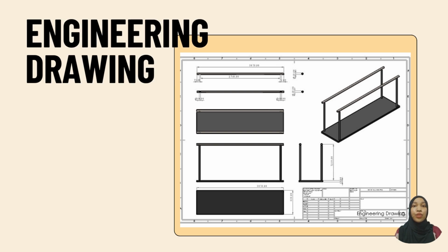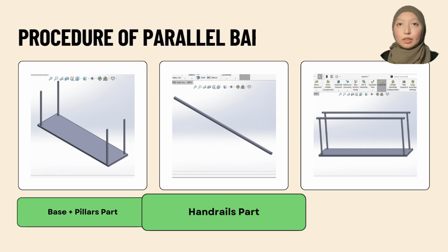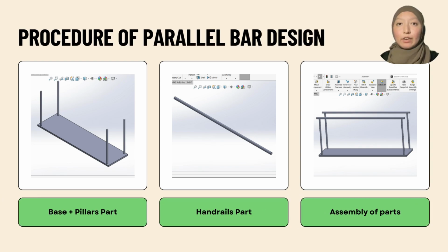This is the engineering drawing of our parallel bar design. It shows the full dimension and structure we created using SolidWorks before running any simulations. The design of the parallel bar was carried out in 3 main stages, involving the creation of the base with pillars, the handrails, and the final assembly.